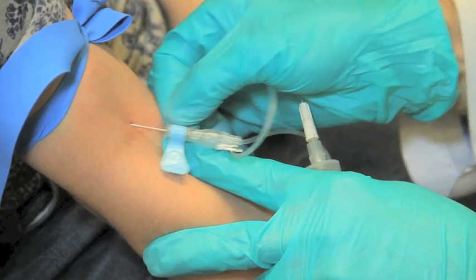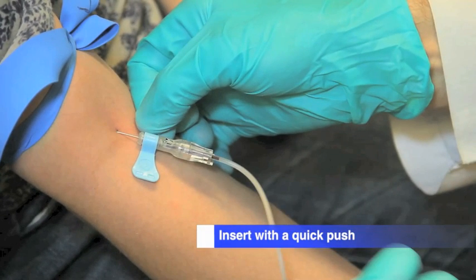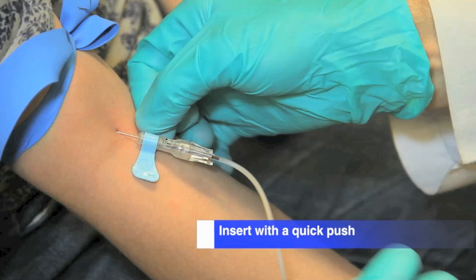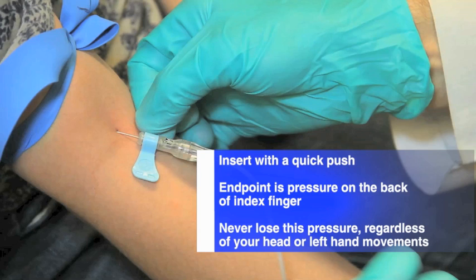When you are ready, insert the needle with a quick push rather than very slowly. Doing this motion quickly will pierce the vein rather than letting it roll away. Use a short, abrupt motion by holding the wing of the needle in between your right index finger and thumb and extending them quickly. The endpoint for advancement of the needle is pressure on the dorsal aspect of your right index finger from the patient's antecubital fossa. Never lose this pressure, regardless of your head or left hand movements. The movements of your right hand should be dissociated from the rest of your body to maintain stability of the needle during the blood draw.